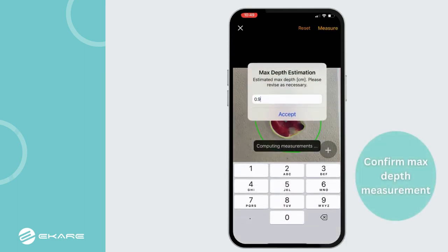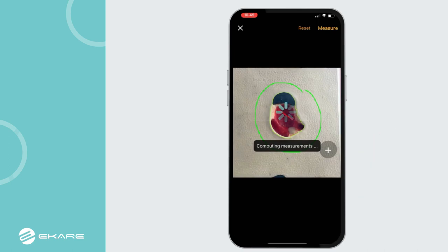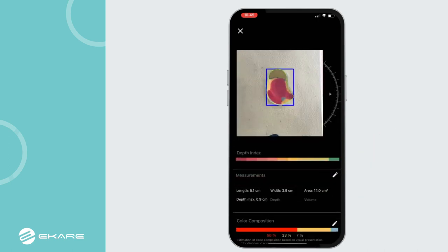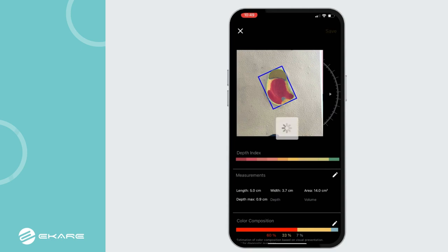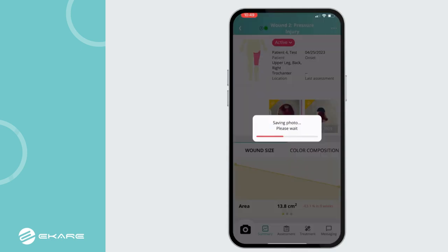Confirm the max depth measurement provided and select Accept. If necessary, adjust the orientation box to ensure best practices for documenting the proper length and width.